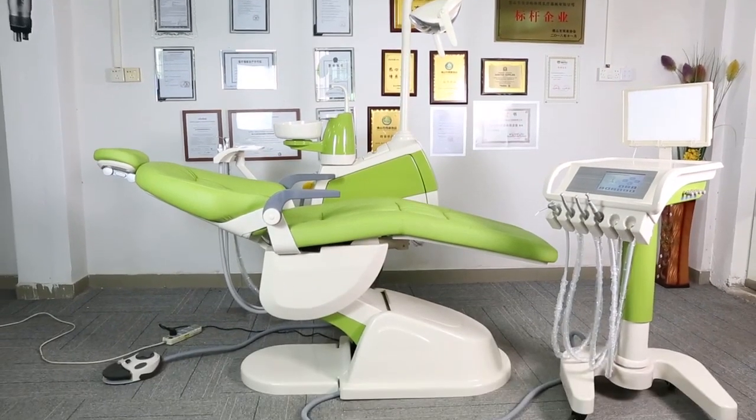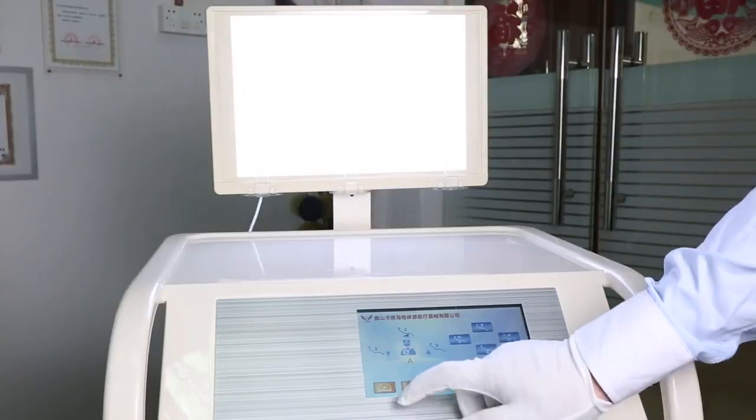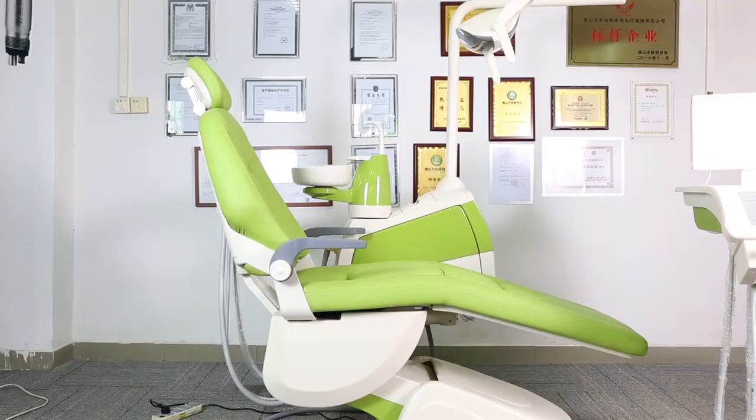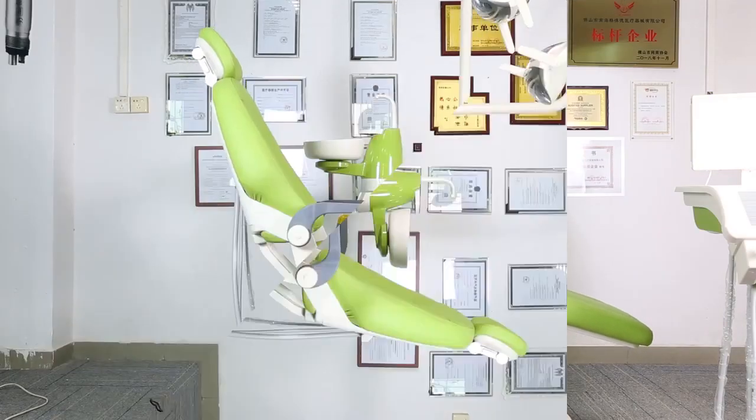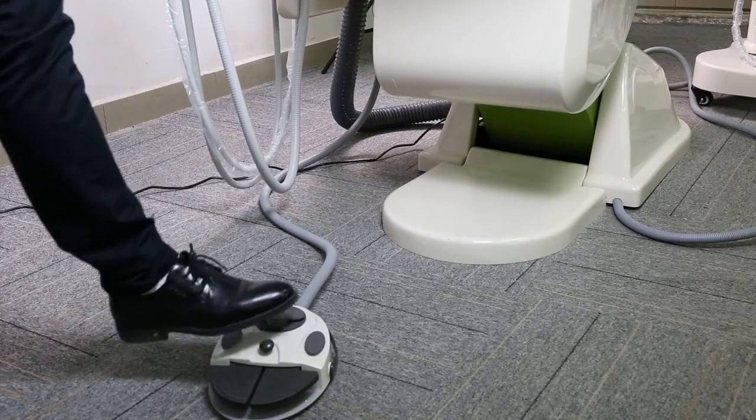CE and FDA-approved Gladant Dental Unit, GD-S350 Integral Dental Unit with Mobile Adjustable Trailer, the Aluminum Compensation Backrest and Microfiber Leather Cushion making patient more comfortable.